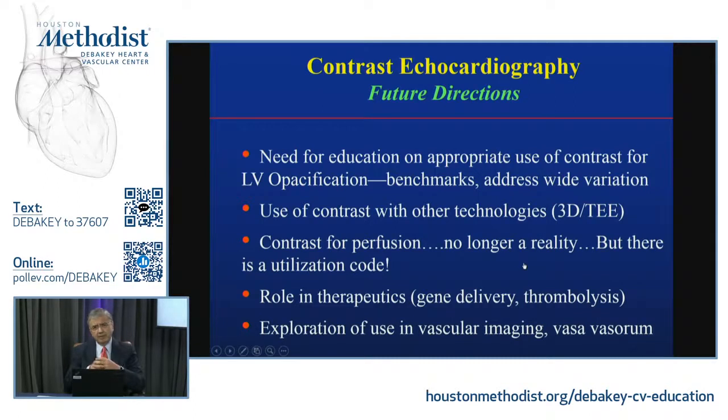And remember, echo, irrespective of what you do, is a first-line diagnostic modality for us to treat and take care of patients with cardiac disease.